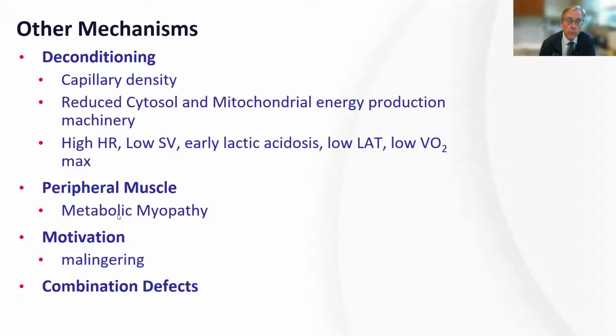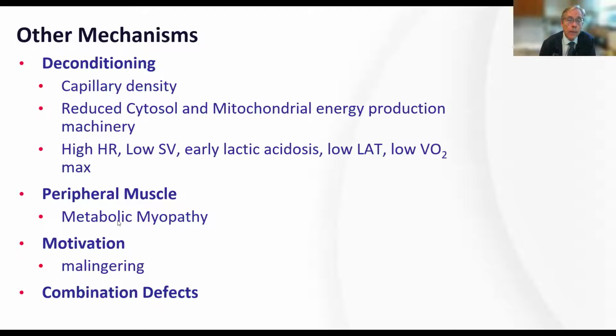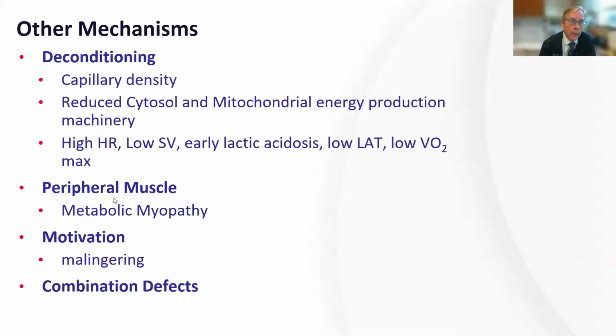these things actually improve. So what I'm going to do is talk a little bit about the peripheral muscles, because we don't think too much about cardiopulmonary exercise testing assessing the periphery, but really your muscles are where the majority of the increase in oxygen uptake occurs during exercise. So you're really assessing muscle function here, not only capillaries and mitochondria, but also the muscle capacity to generate ATP.